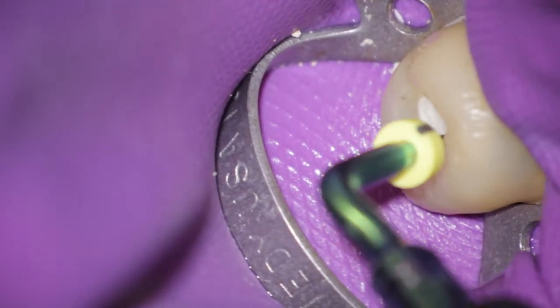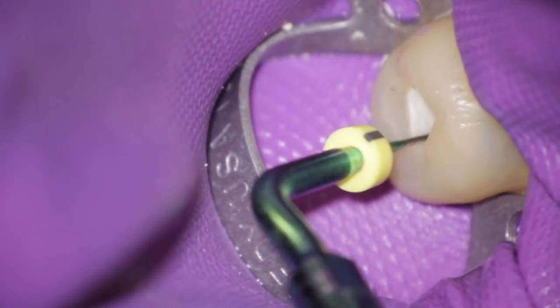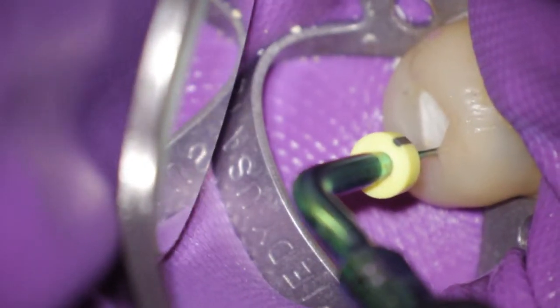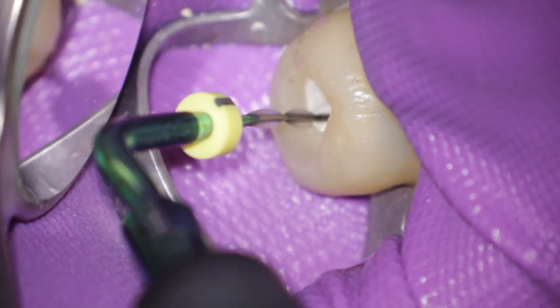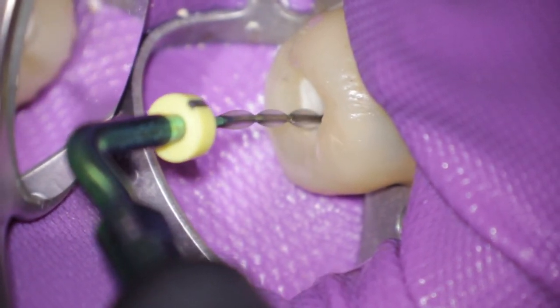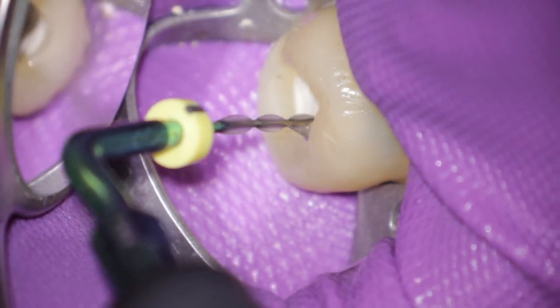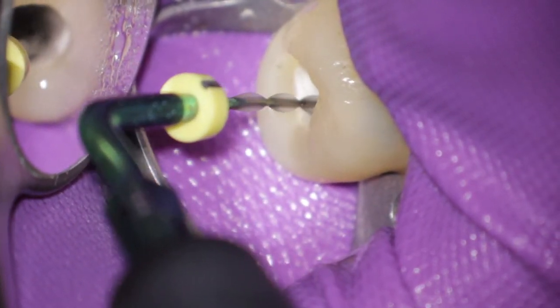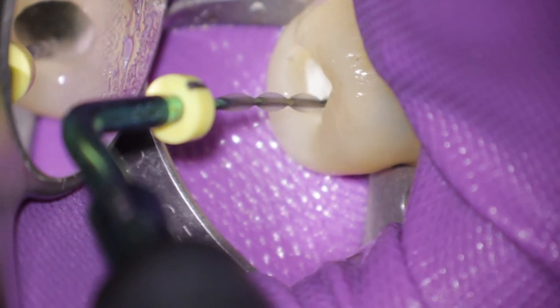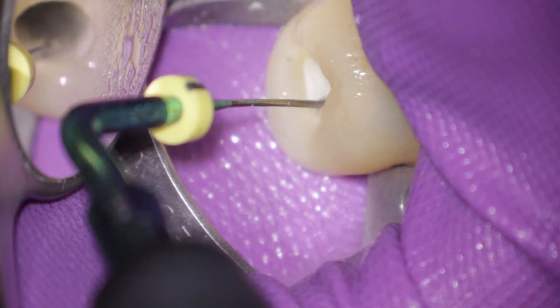I tried to show it in slow motion, but the explosions are too fast for the frame rate of my camera. But I think you get the point, and you see the power. Imagine that power on the canal walls, and you can imagine the cleaning effect of ultrasonics during irrigation. Nodes and antinodes, and now see how they explode. Bam! This is very amazing.